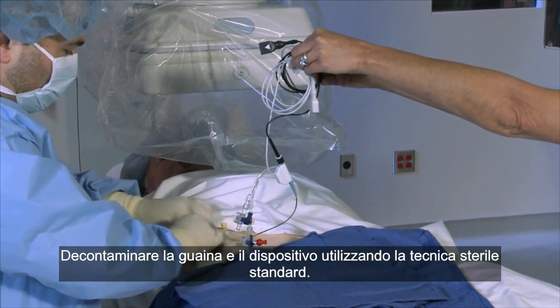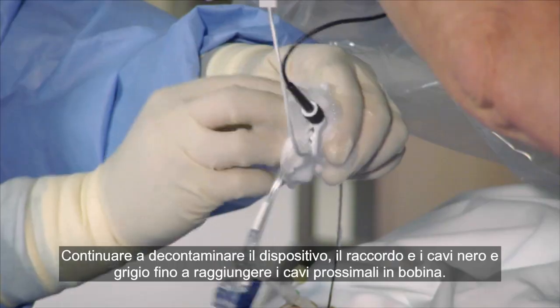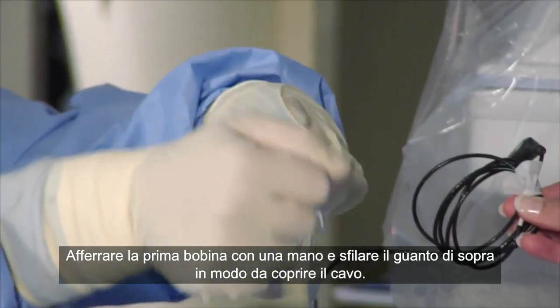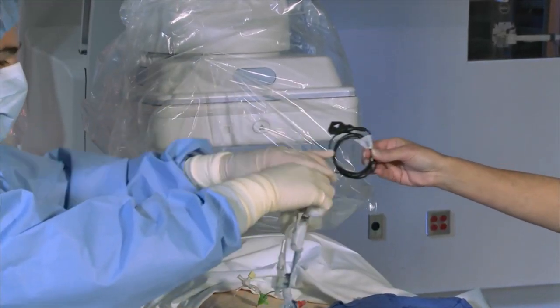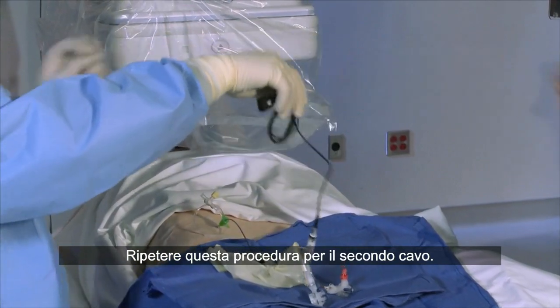Decontaminate the sheath and device using standard sterile technique. Continue to decontaminate the device, hub, and black and gray wires until you get to the proximal coiled cables. Grab the first coil with one hand and pull off your top glove to cover the cable. Secure glove with steri-strip. Repeat this procedure for the second cable.